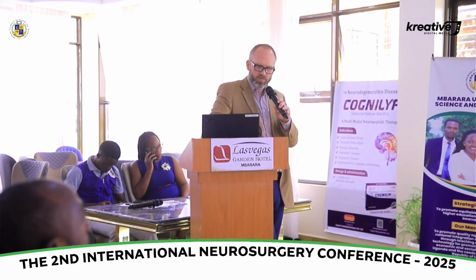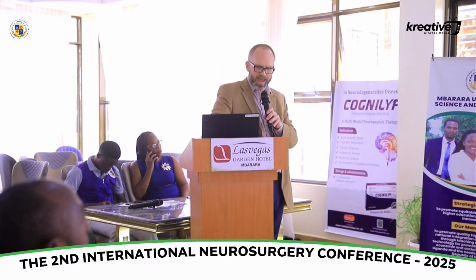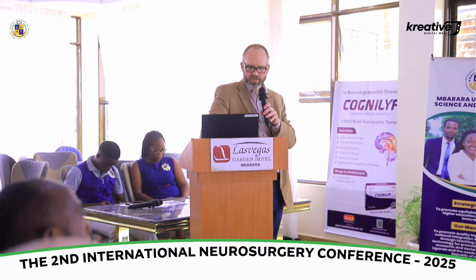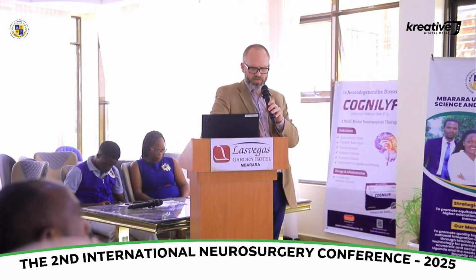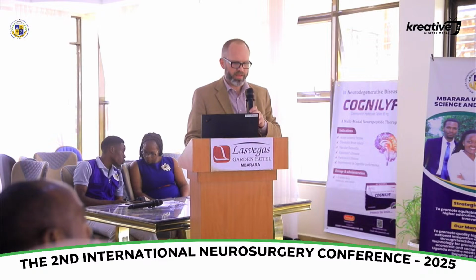With practice, ultrasound can greatly enhance cranial surgery, lesion localization, catheter placement, abscess aspiration, needle biopsies, etc., and can be useful in the brain, spine, or for peripheral nerve surgery. Thank you very much.